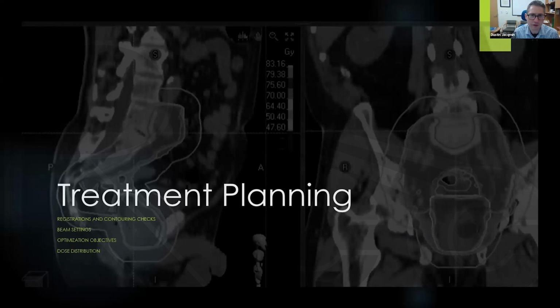How do your radiation therapists adjust? You get the patient there the first day, things aren't quite right. Do you have a good process for iterating, working with the patient to figure out how to change the instructions to get exactly what you need? How does your clinic handle that?